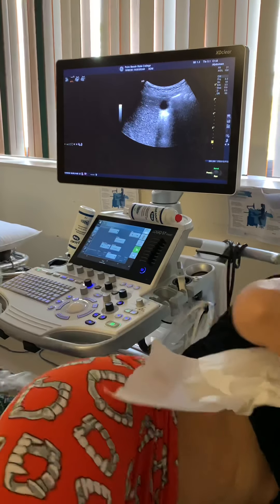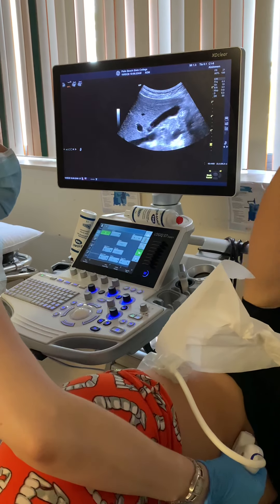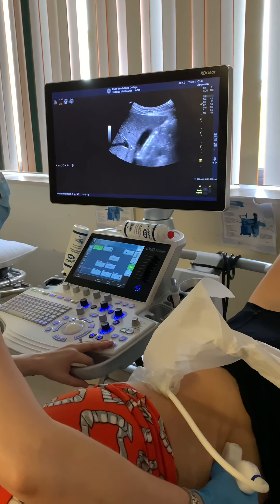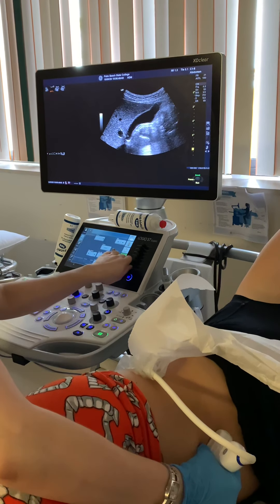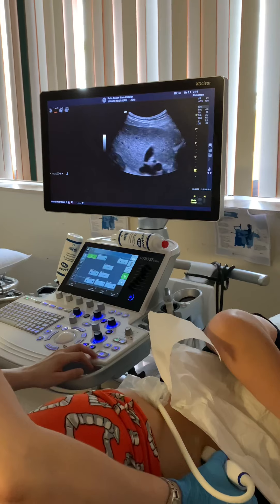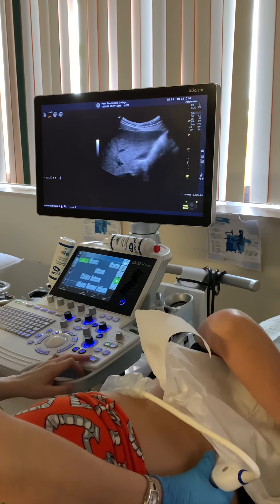Now we have our patient turned to their side — this is going to be your left lateral decubitus. You're going to show both a sagittal and transverse picture in decubitus. Does anybody know why we show it in two different positions? — Just to see if anything moves within it. If there's any stones or any debris, we'll see if it's moving. We can use our TGCs to clear out any internal echoes. This is going to be your sagittal decubitus picture, and then your transverse decubitus picture — transverse is going to be the circular one.